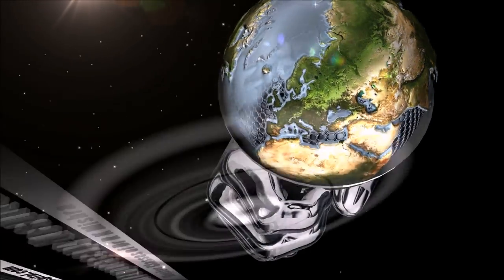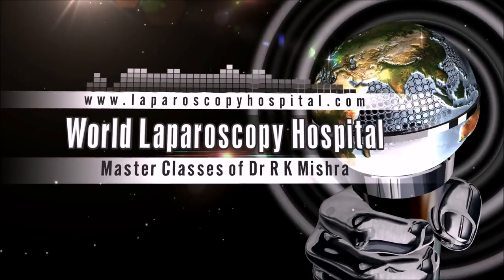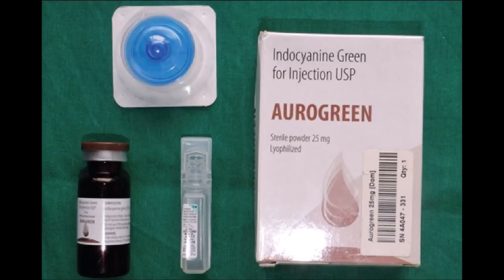Hello friends. Safety of the cholecystectomy is very important and nowadays Indocyanine Green has revolutionized the way we can prevent CBD injury.